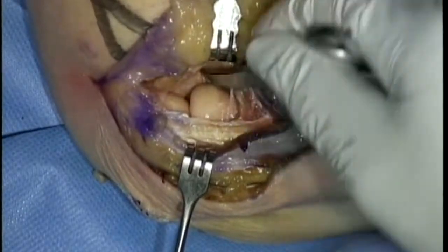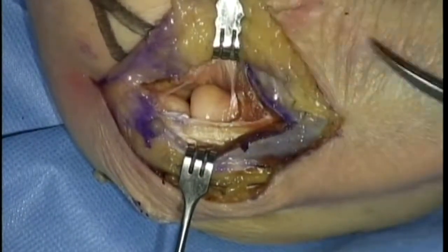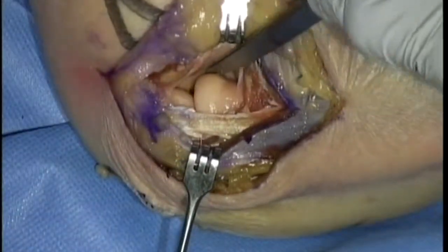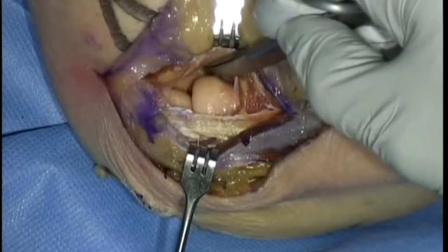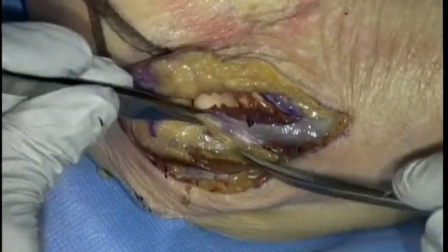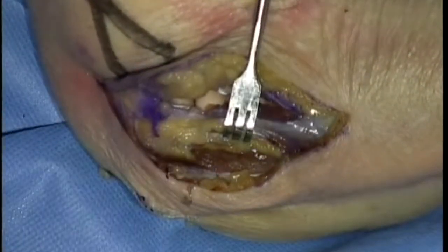And if you're going to do a terrible triad, usually this is a full stop, so you're going to work across the front. And you can see you can get a pretty good view across the elbow with this, especially if you're taking out your radial head. You can see right into the coronoid. With the Kocher exposure, we'll all do this in the lab, but you're going to take all of this off.